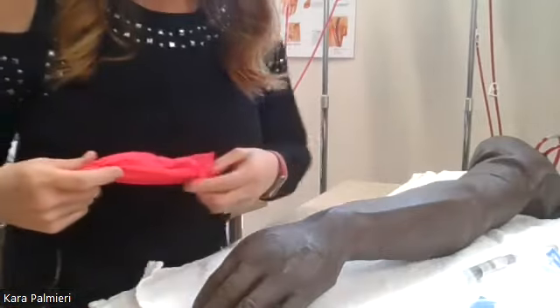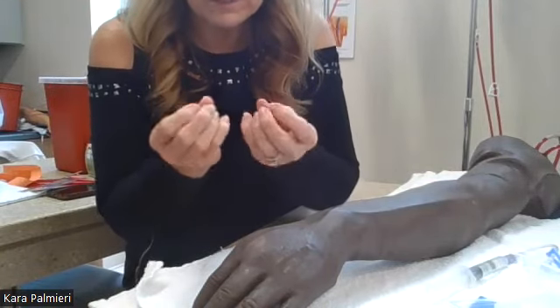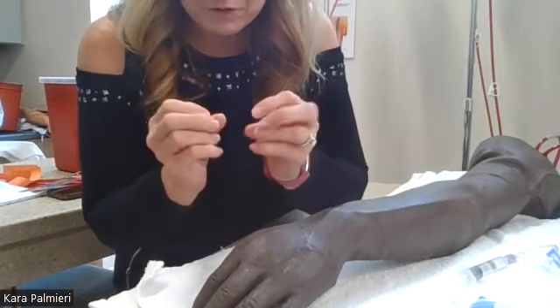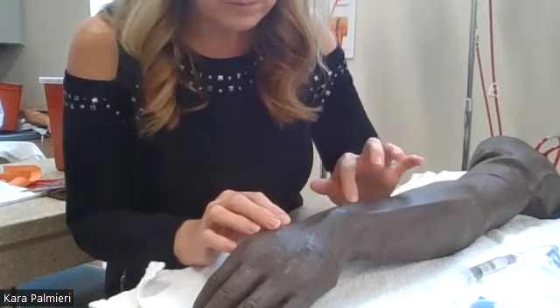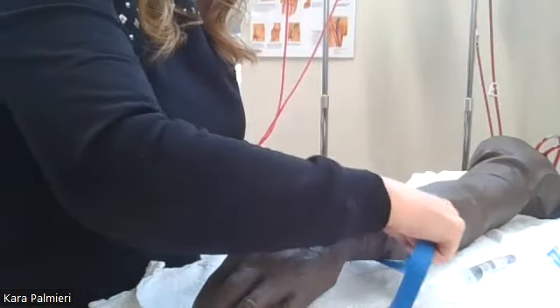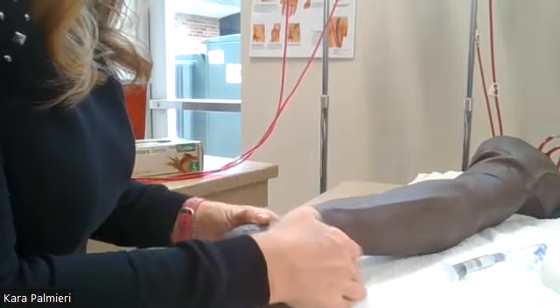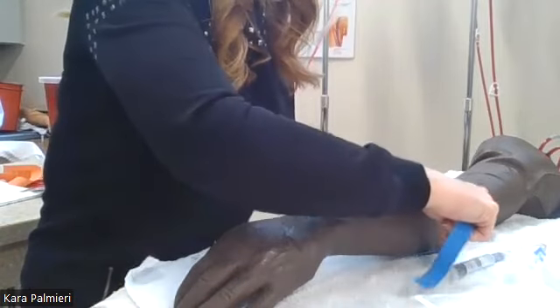Okay. And typically I like to look for my vein first so that I can use my fingertips because they're the most sensitive part. That's what guitarists know all about this. You need to use your fingertips because they're very sensitive and they can feel the bouncy vein, and it will feel bouncy to you. So I'm going to first put my tourniquet on. And let's see where I want to go. You may or may not get an actual flashback on these IV arms.